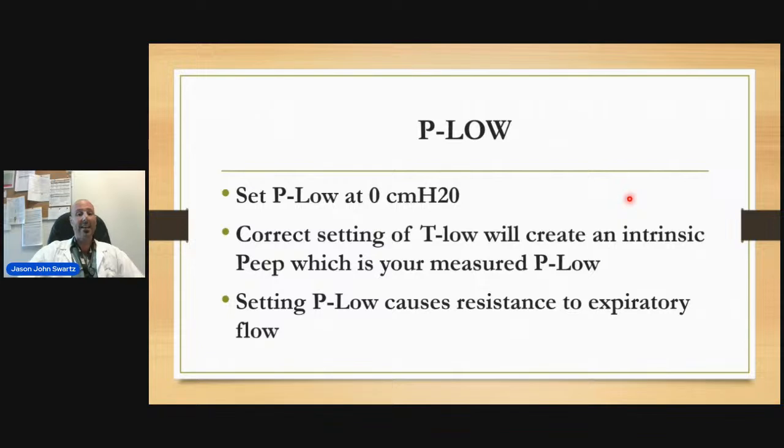Now, the correct setting of your T low will create an intrinsic PEEP, which is your measured P low that you're going to do with an expiratory pause.